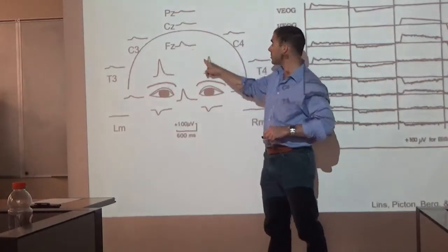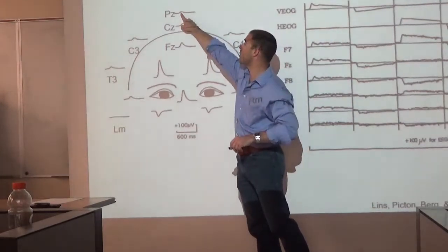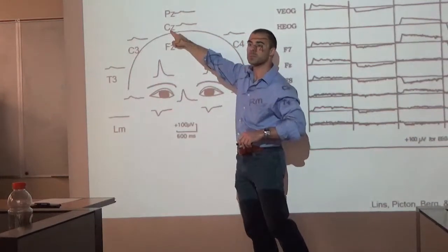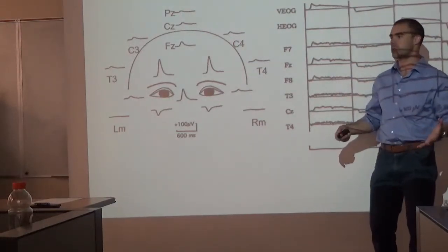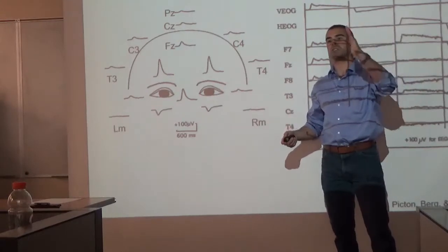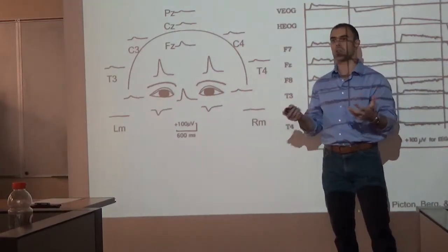When you're really close, that's a bigger bump. The bump gets a little smaller, and even smaller when you go to the posterior sites, the central sites. A lot of that is because there's a decay function, the rate at which electrical activity decays as it spreads through human scalp tissue, which is relatively constant.